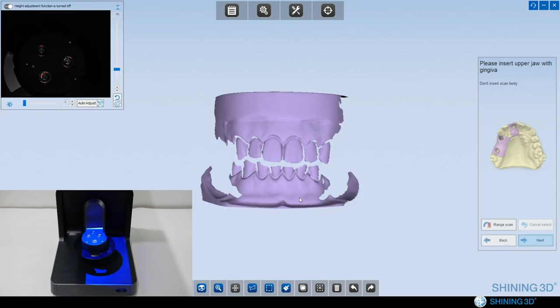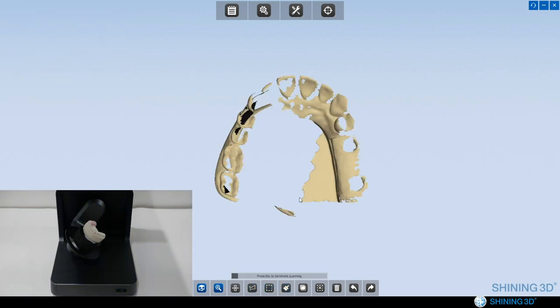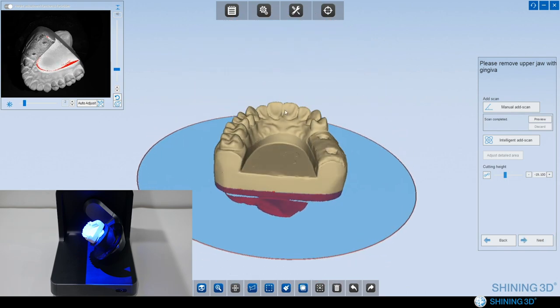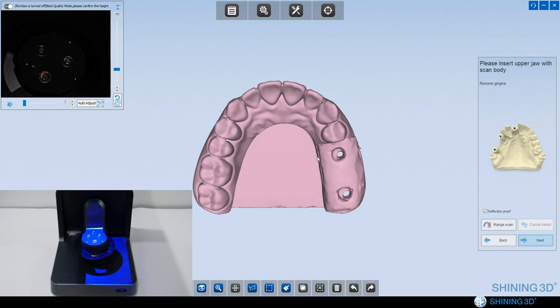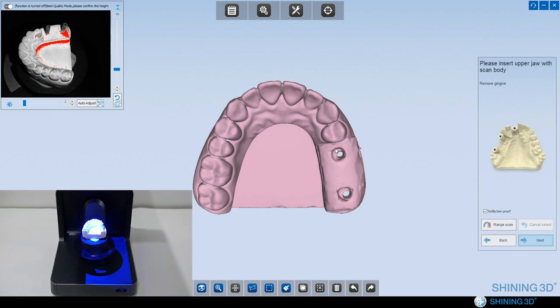In this step, you need to insert the upper jaw with gingiva, not scan body. Okay, gingiva scan finished. Next, we need to insert the upper jaw with scan body. Remove gingiva. Click next.